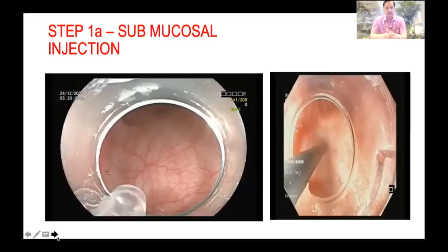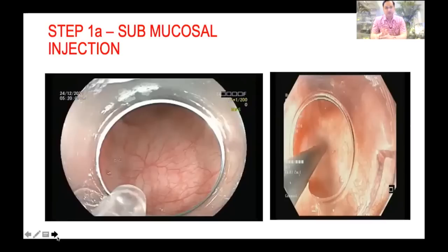To make a mucosal incision, first go to the GE junction, mark on your scope, then come back approximately 10 centimeters. To identify the site of mucosal injection: if you want to perform a posterior POEM, the mucosal injection should be at 5 o'clock; if anterior POEM, it should be around 2 o'clock. The posterior approach should be lateral to the spine.